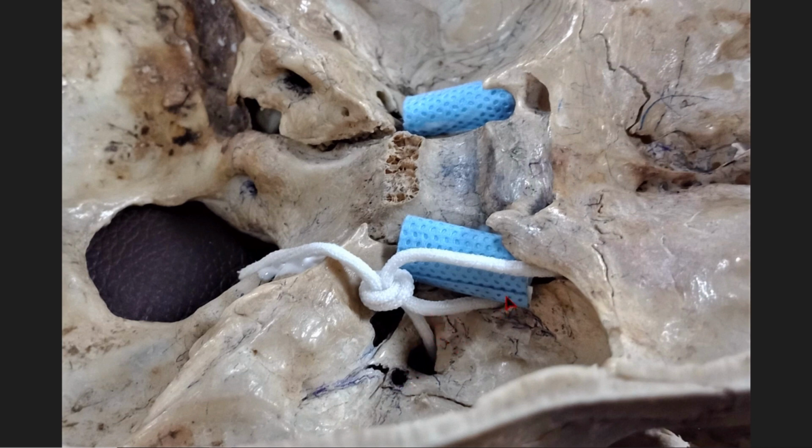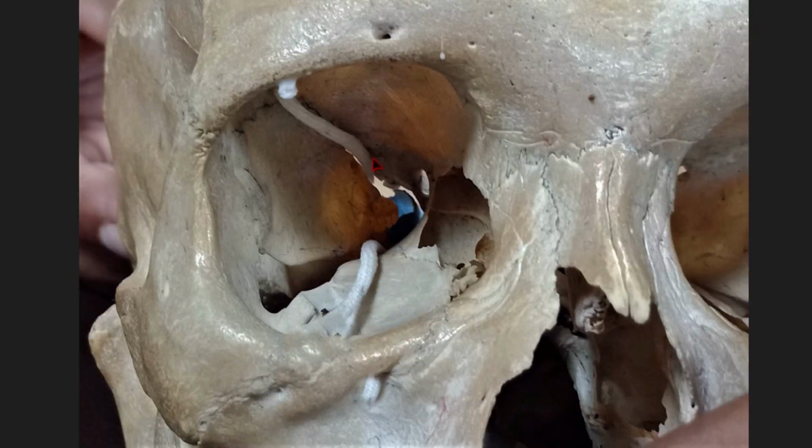V2 is going through the foramen rotundum and V1 is going to the superior orbital fissure. They are all placed in the lateral part of the cavernous sinus. This blue part, I made it like a cavernous sinus. If we see from the front, we can see how V1 is coming out through the superior orbital fissure, V2 is coming through the inferior orbital fissure.